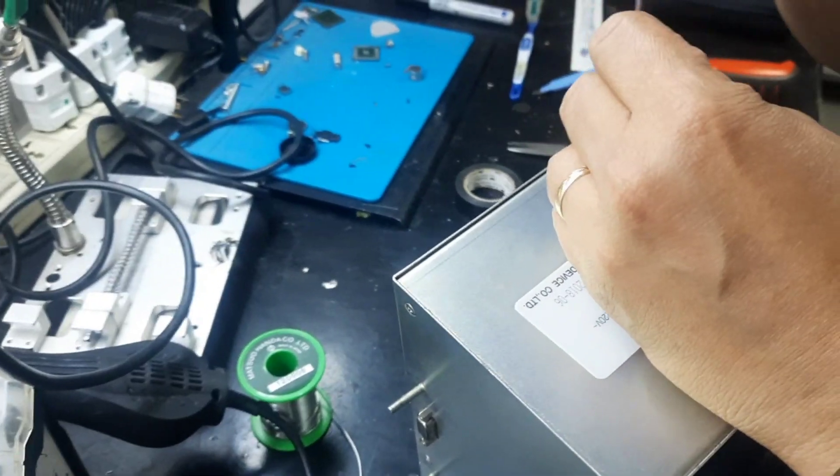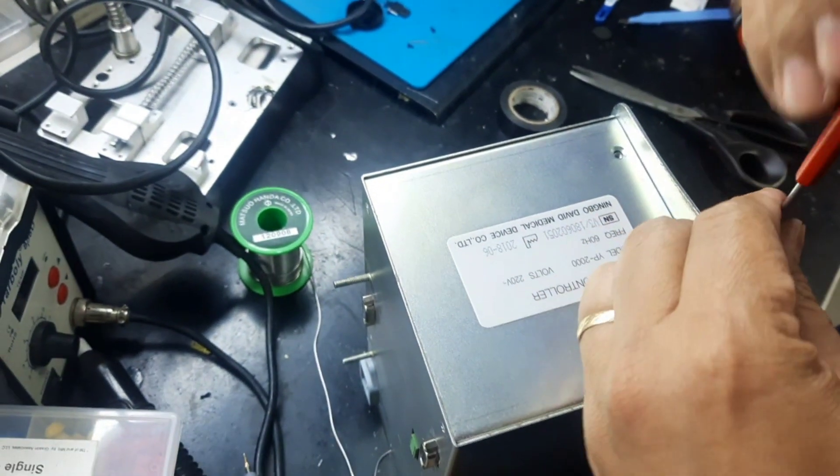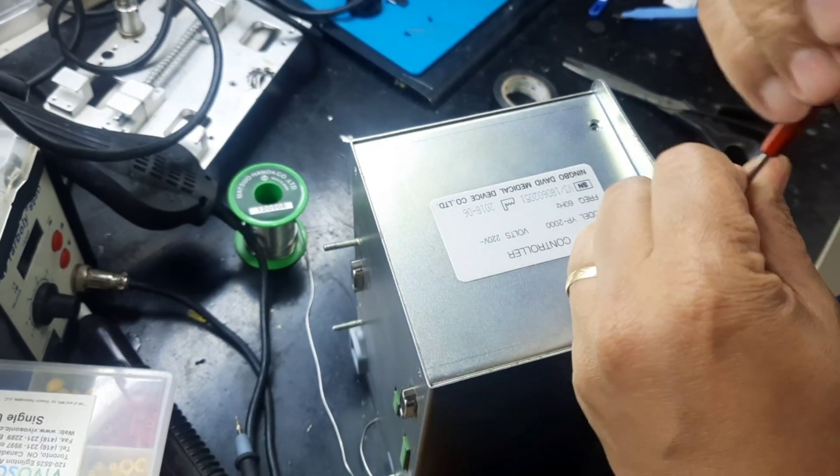Come here. Open only this. Four screws. Both sides.